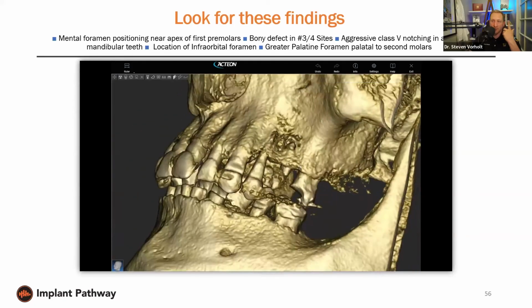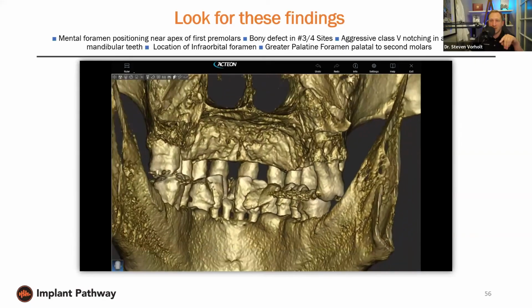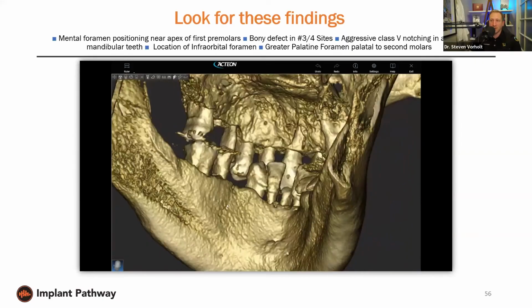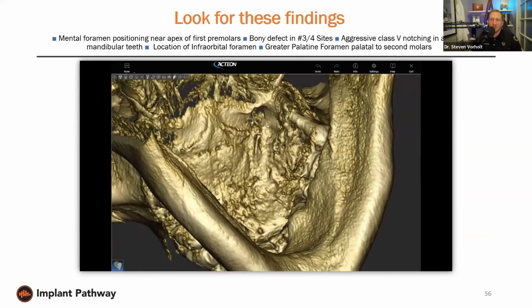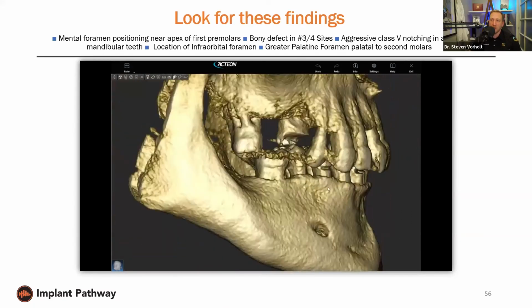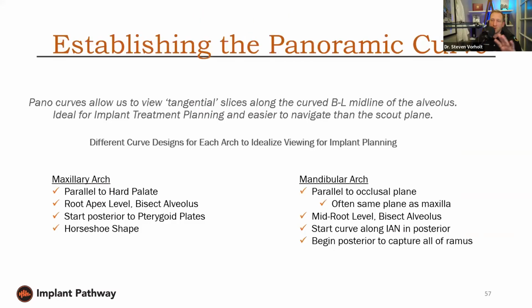If we're going to be doing an infraorbital block, for instance, floor of the nose, and then looking at them from the throat view, essentially, we can see there the mandibular tori, the greater palatine canals. If we're going to do a V2 block, for instance, and all that gross anatomy that we need to see. So that's a very quick rundown of how to do the initial read.